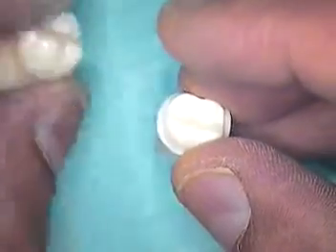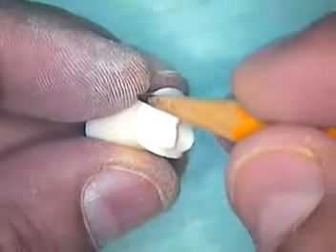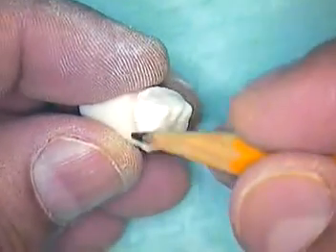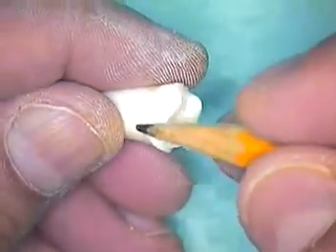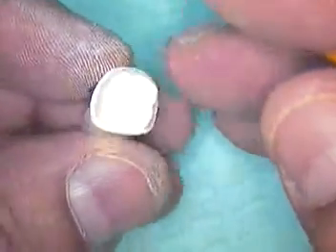Let's talk about the prep. The preparation now has a full chamfer margin that's half the diameter of the tip of the burr, and that goes all the way around with a nice sloping design to it.